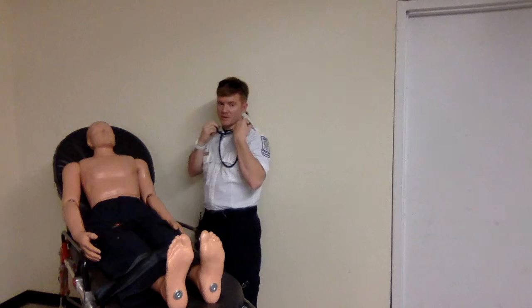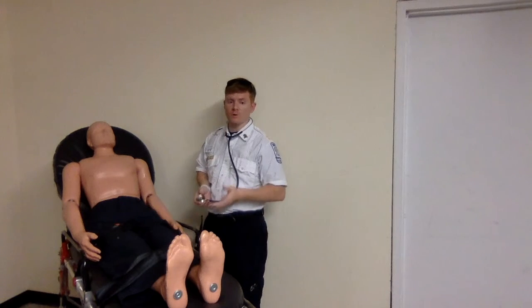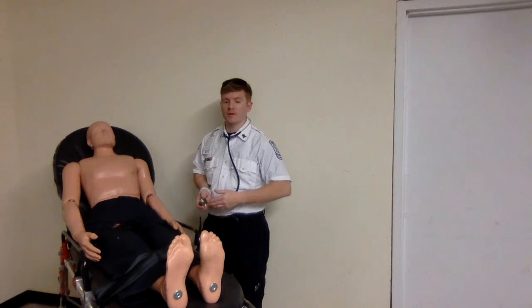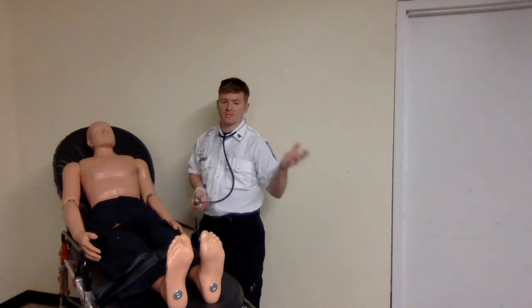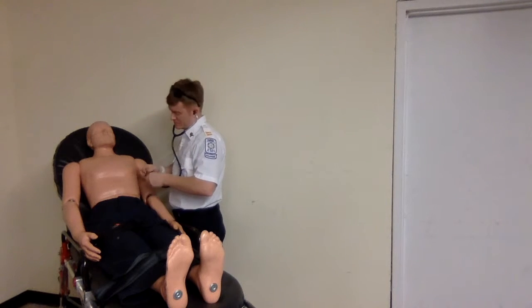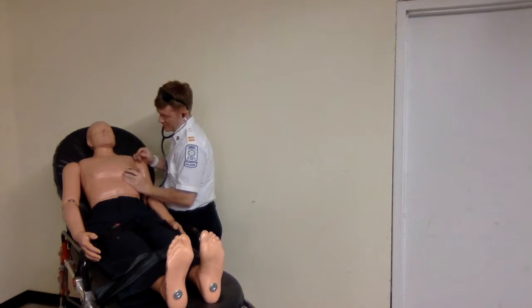And then after we're done with that, we're going to use the bell to listen for any extra heart sounds, noting any gallop, any murmurs, any clicks, any rubs. So using the bell of the stethoscope, we'll turn it over and we'll do the same thing again.